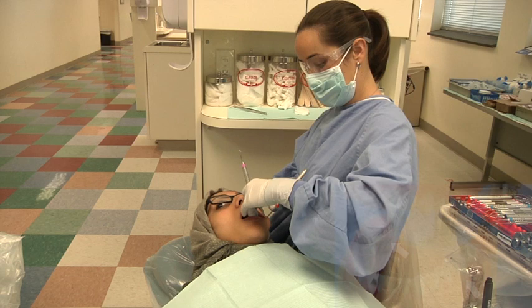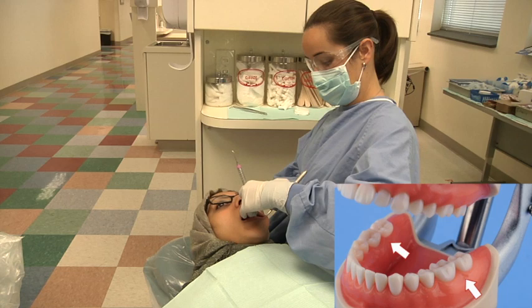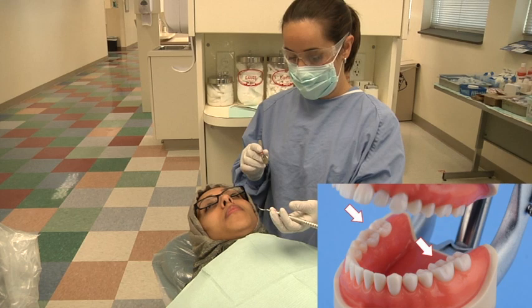For the left-handed clinician, the same concept is used where the 3 o'clock position is assumed for the posterior aspects facing towards the clinician, and the 1 to 2 o'clock position is assumed for posterior aspects facing away from the clinician.